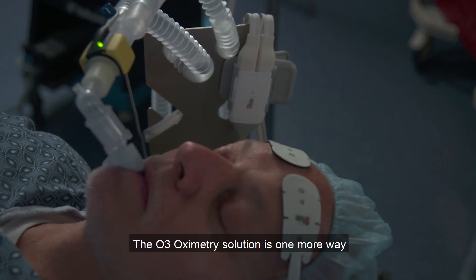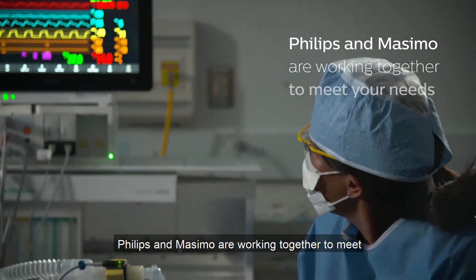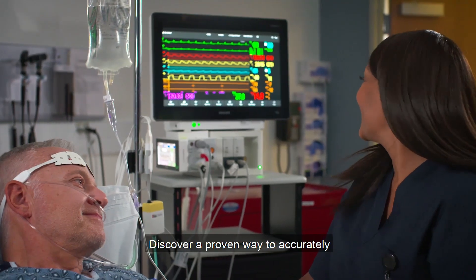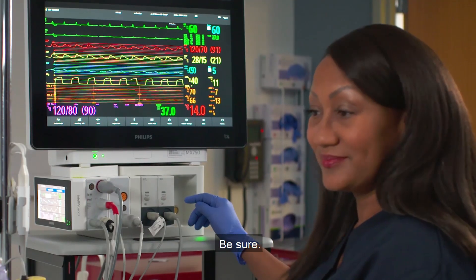The O3 Oximetry Solution is one more way Philips and Masimo are working together to meet your need for multi-parameter monitoring in the OR and ICU. Discover a proven way to accurately monitor cerebral oxygenation. Be sure.